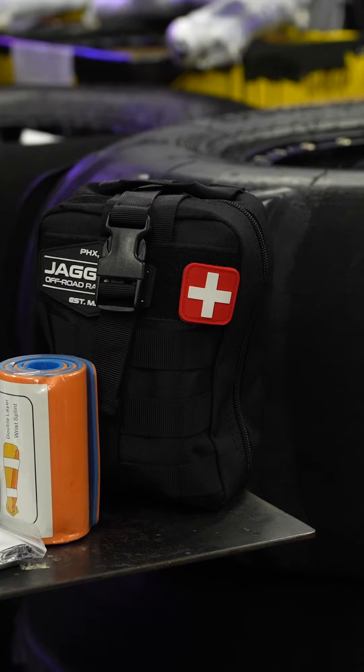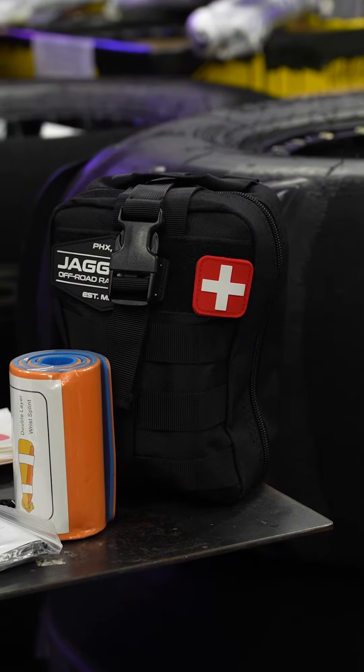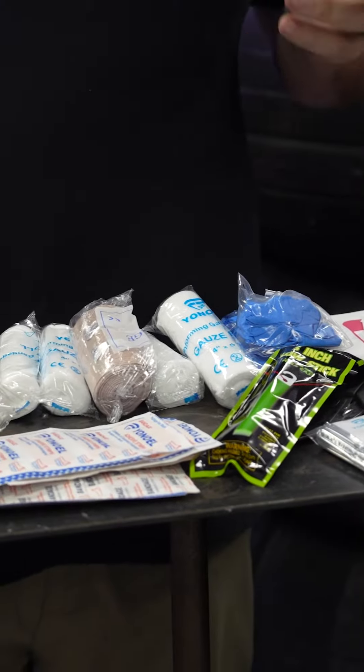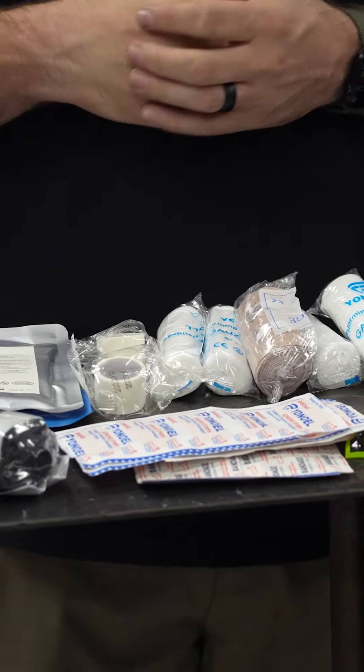Let's talk about our Jagged X first aid kit. This particular kit is called the Jagged X Advanced First Aid Kit. We're going to go over what's in it. It's basically for the desert, dunes, anywhere out there — you never know what you're going to come across. You might encounter a stranded biker, a hiker with an injury, or another car involved in a collision. We try to get everything covered so you're prepared for any incident out in the wild.